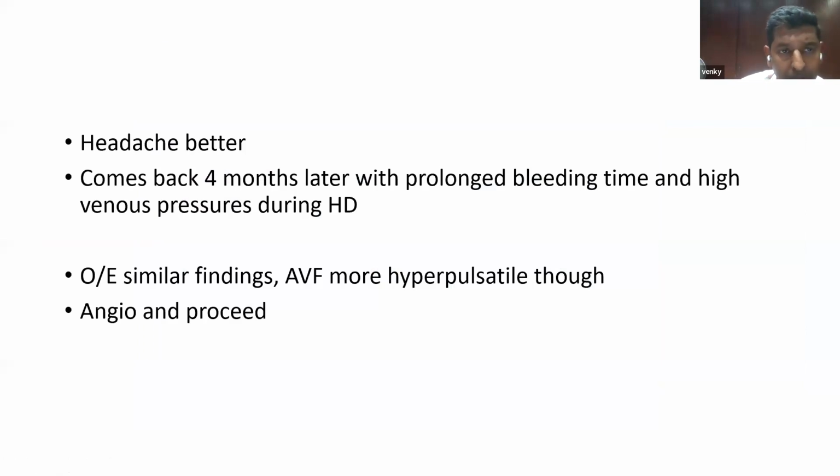The patient went home, and his headache was apparently a little better. And he came back sometime later with a prolonged bleeding time this time and with high venous pressures during dialysis. On examination, the findings were similar, but for an even more angry-looking hyperpulsatile fistula. And we did an angiogram again and decided to proceed further.